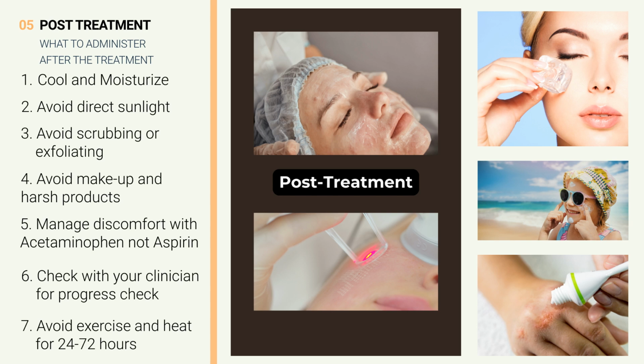Post-treatment recommendations. For optimal results, these must be followed and adhered to. 1. Cool and moisturize the skin, using a cold compress or chiller device if available. 2. Avoid direct sunlight and use broad-spectrum sunscreen SPF 30 or higher. 3. Avoid scrubbing or exfoliating. Let skin heal naturally, without picking. Gentle cleansing with non-irritating, fragrance-free products is highly recommended.